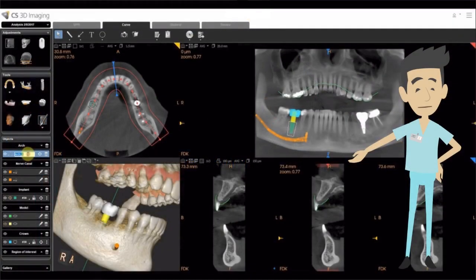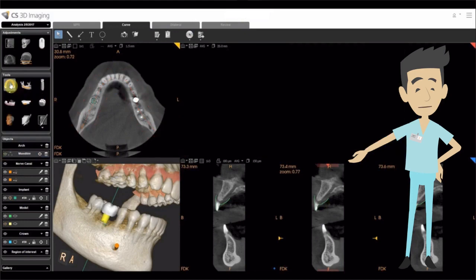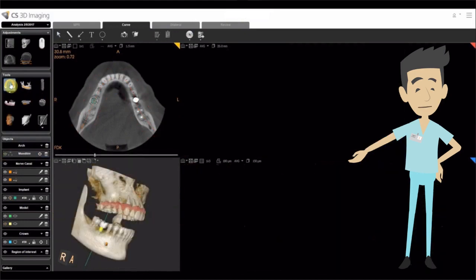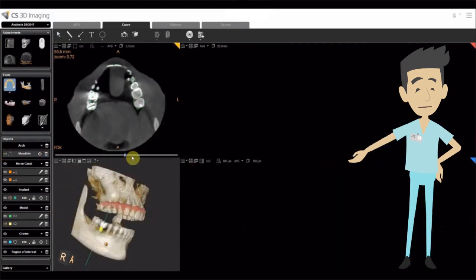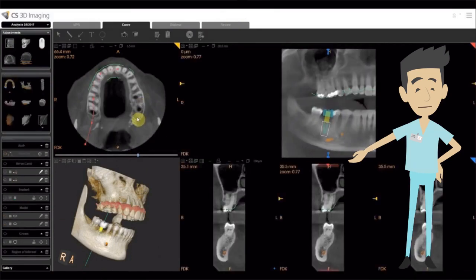The capability to trace two jaw arches is now available. When both jaws are involved in a treatment plan, tracing both arches will result in optimized reconstructed images. The tracing operation is very simple.